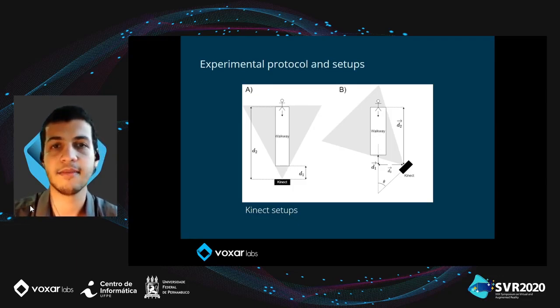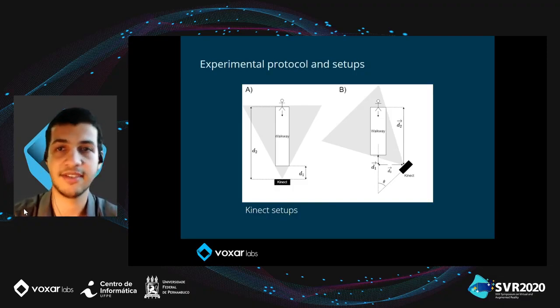The algorithm proposed in this research was developed based on different users' gait, recorded by both a golden standard camera and the Kinect. The volunteers were placed at the beginning of a walkway and were asked to stand upright and then start walking at a comfortable pace. We used marks on the floor to predetermine the steps length and the number of steps taken by each volunteer to compare the outcomes and expected values easier.